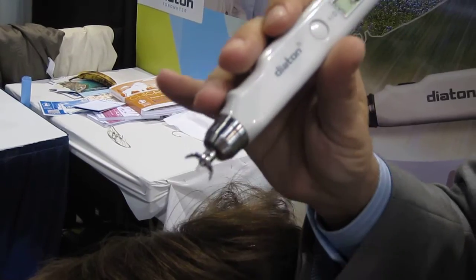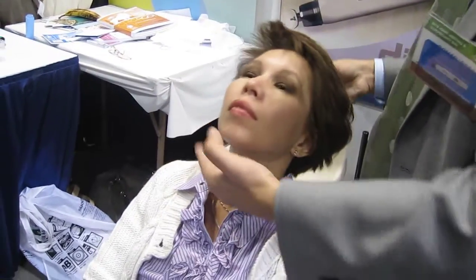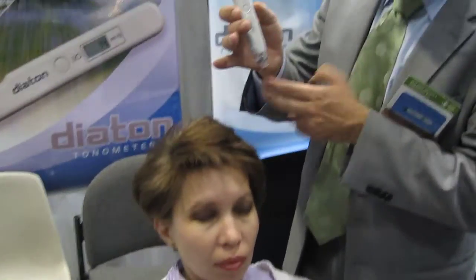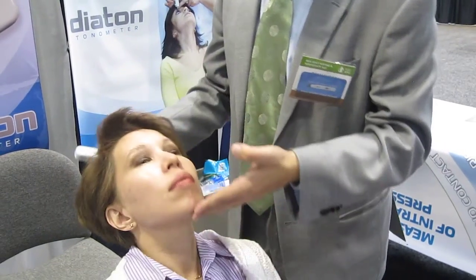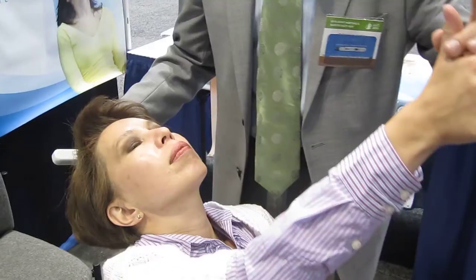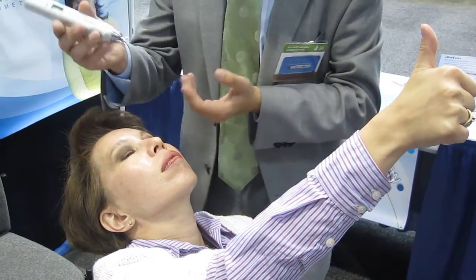For the second eye, the patient is already positioned properly. If you are right-handed, you are on the left-hand side of the patient because you want to make sure you are using the edge of your palm on the patient's forehead — that's for stability. Make sure the head is as horizontal as possible and extend the finger at approximately a 45-degree angle.